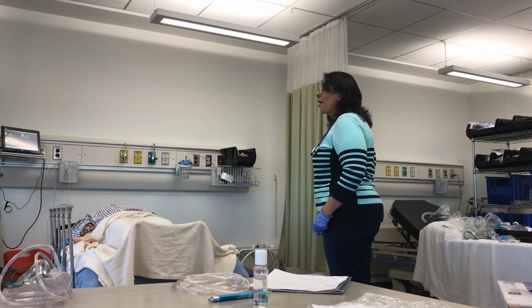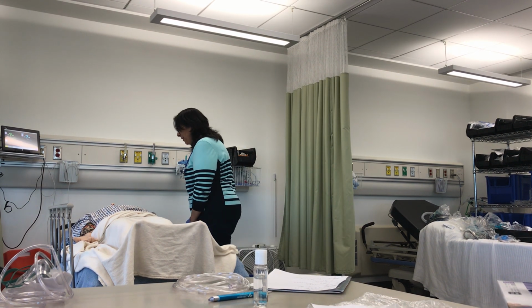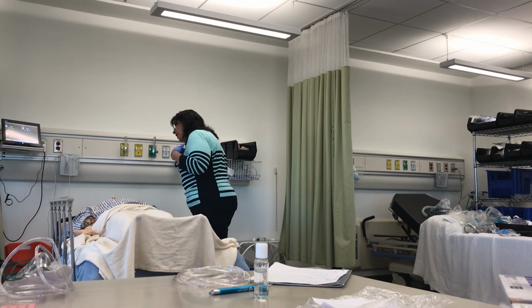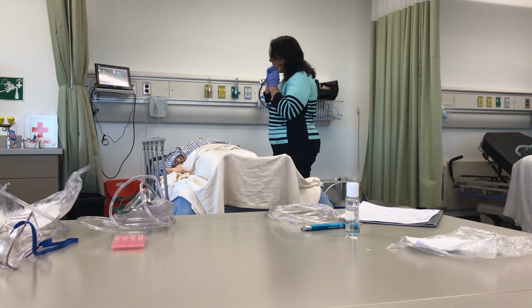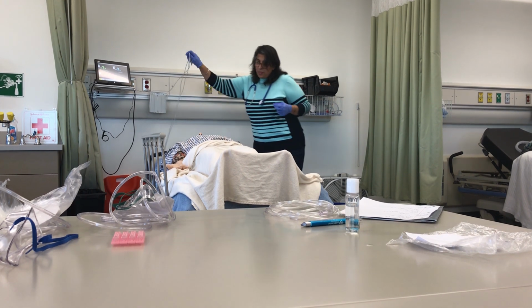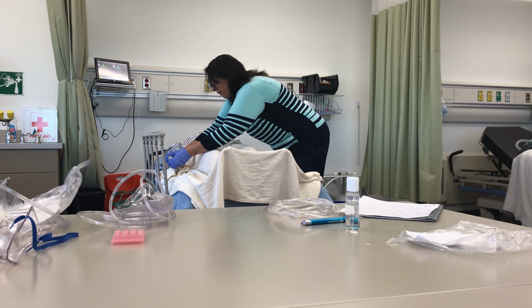Oh, hi, how are you, Mr. Dumbledore? Oh, I'm feeling pretty short of breath, actually. I'm so sorry. I'm new from respiratory therapy. I'm your respiratory therapist for today, and I'm gonna take care of you and see what's going on. Okay, so let me just put this pulse ox on to see what your oxygen level in your blood is in the meantime.